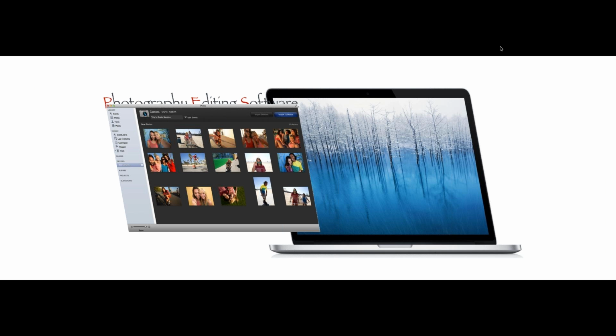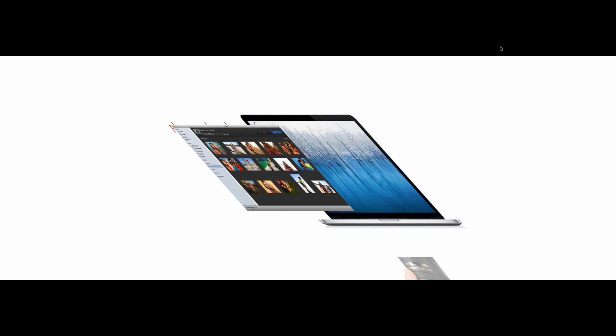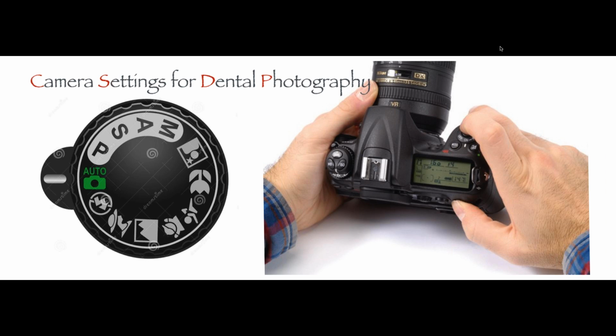And obviously, once you take the photos, now you have to use some basic editing software for cropping and making your photos straight. So basically, you don't need any special or sophisticated editing software, because all you're going to do is just spend money. If you take a high quality photo, all you need to do is put it straight and crop and then save it. That's all you need to do. Just any type of software that can arrange the position of the photo and then finally crop it.